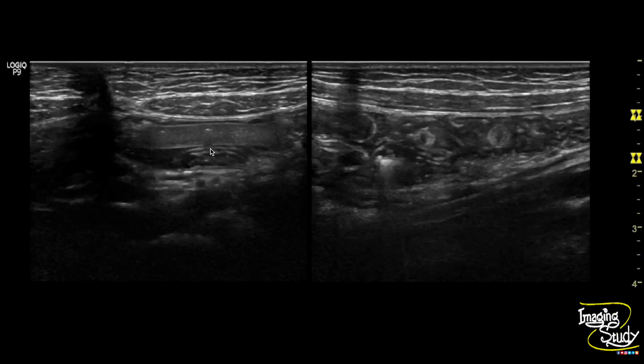Here is the longitudinal and transverse section of the Ascaris lumbricoides within the small intestinal lumen.